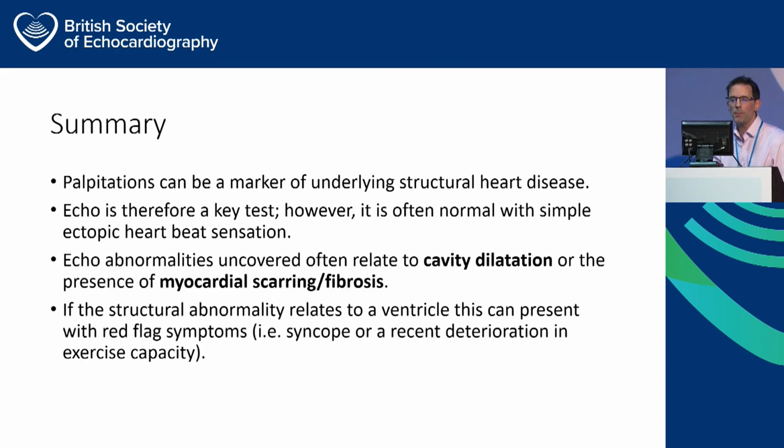So, in summary, palpitations can be a marker of underlying structural heart disease, and therefore echo is an absolutely key test. However, you've got this conflict between the severity of symptoms and the presence of underlying pathology. And I would say, particularly if people have got simple ectopic heartbeat sensation, the scan will often be normal.